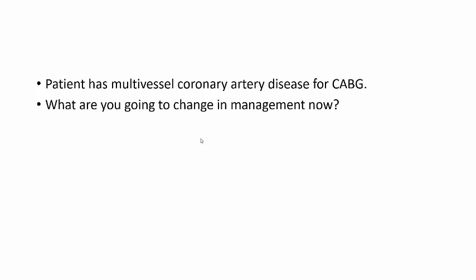The take-home message: advanced critical care ultrasound is not only diagnosing left side heart failure, but you should know about hemodynamics, about left atrial pressure. If it's high, you will diurese the patient. If it's low, you can give fluid challenge.